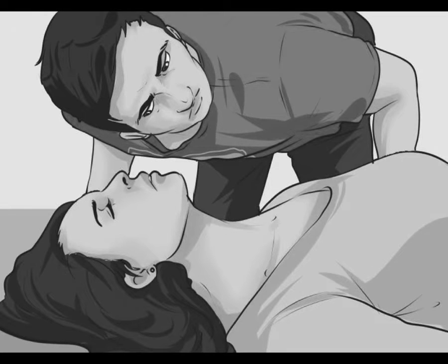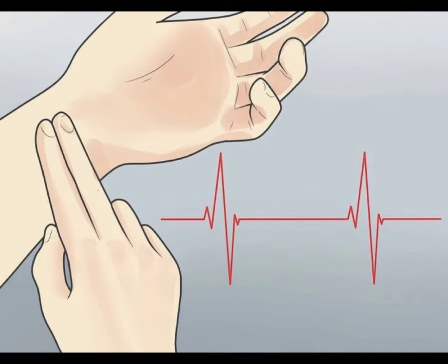So the decision to start CPR in an unresponsive patient, either in-hospital or out-of-hospital cardiac arrest, is based on the absence of a central pulse, correct? So we have an unresponsive patient, we check for a central pulse, and then we call it cardiac arrest. We start CPR. But there's a few problems with this, and there's good data to support that. The decision to start CPR based on either radial, femoral, or carotid pulse is problematic, as there's good literature supporting the fact that the palpation of the central pulse with our fingers is simply not sensitive enough.